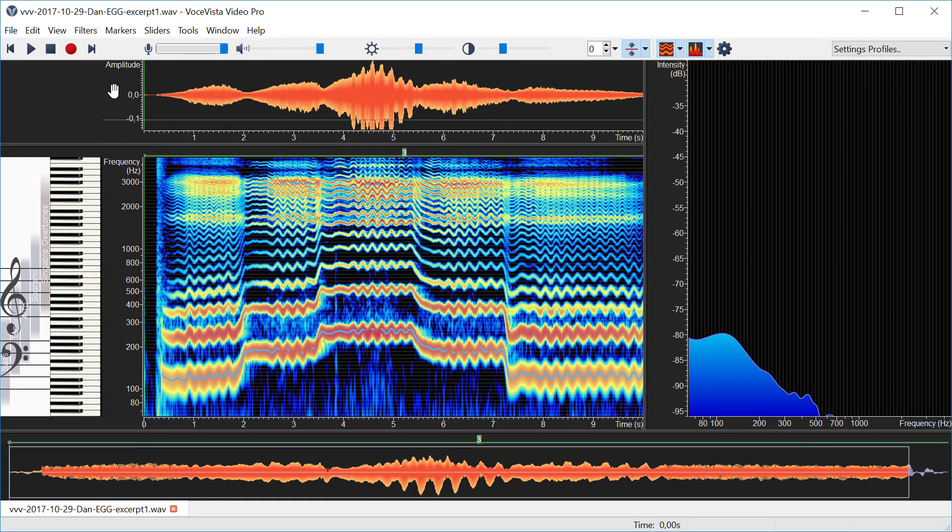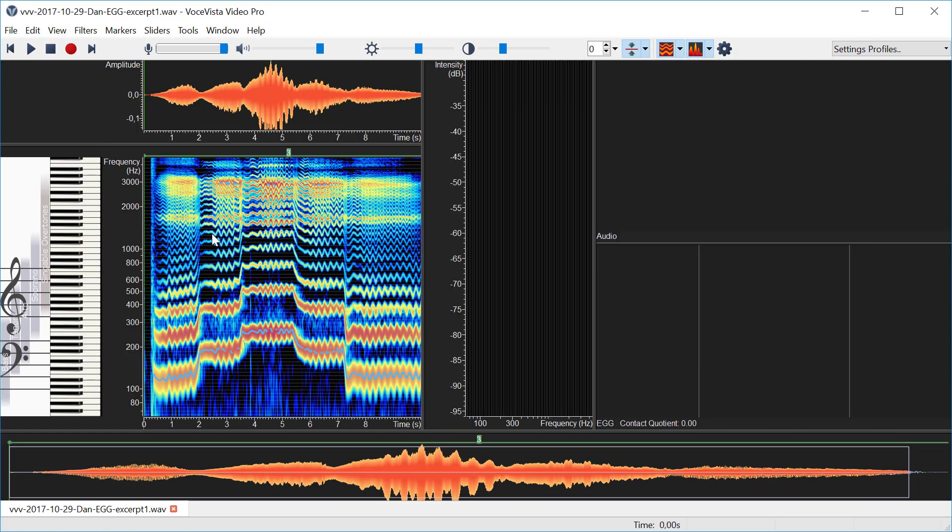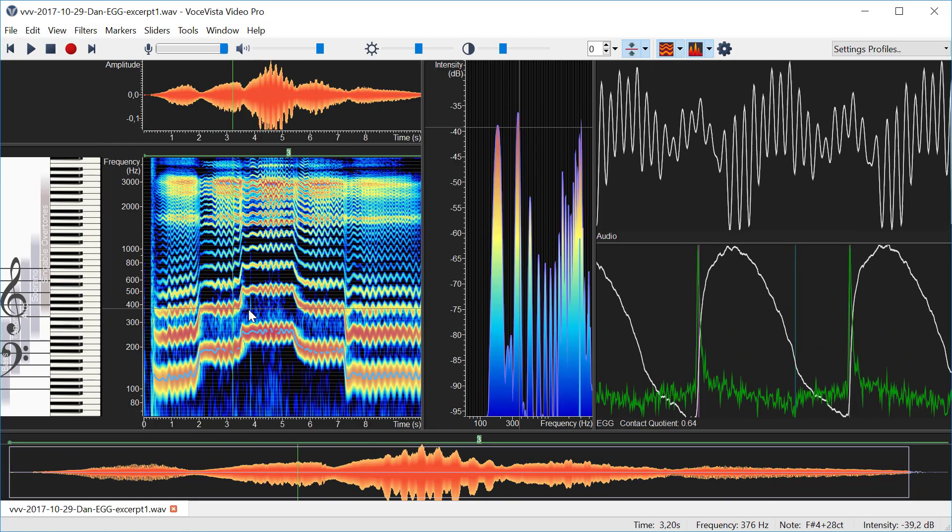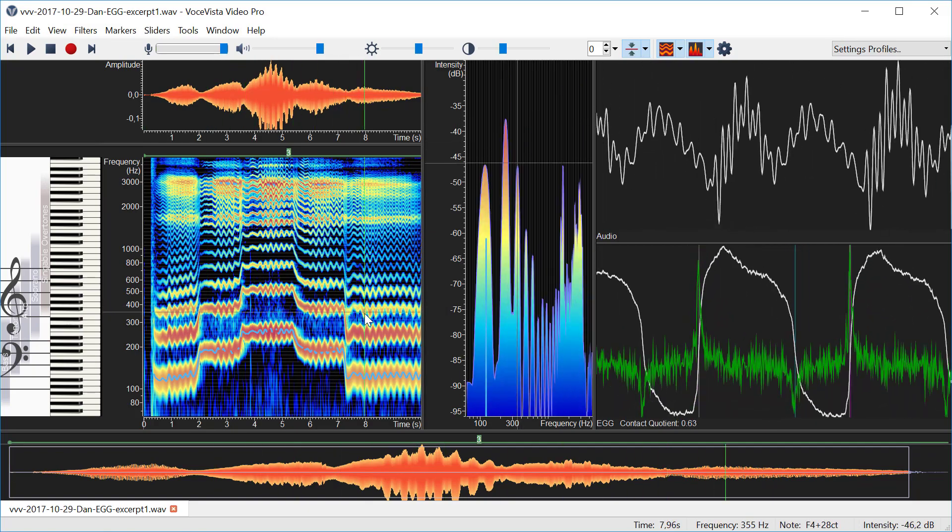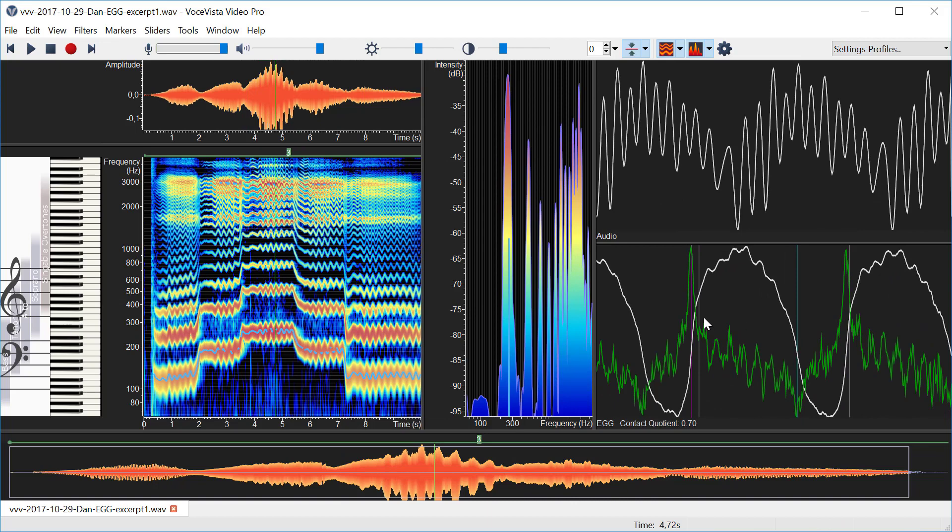And then the next thing is to go to the view menu and turn on the short-term audio and EGG view. So now if I click with a mouse anywhere I can see my EGG at the bottom and the audio data at the top.